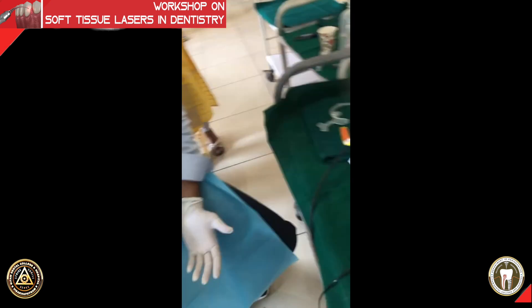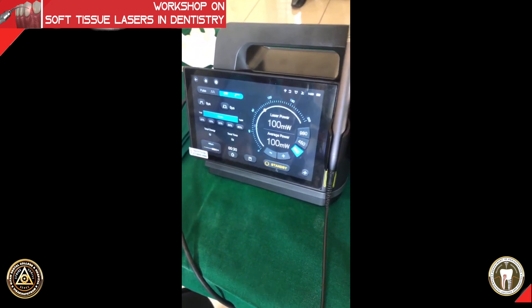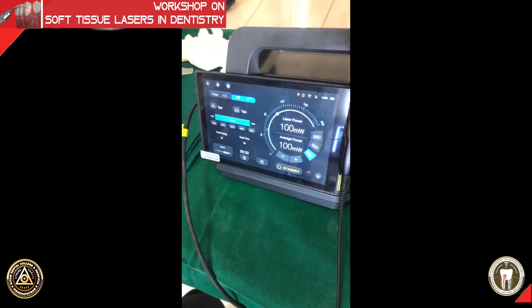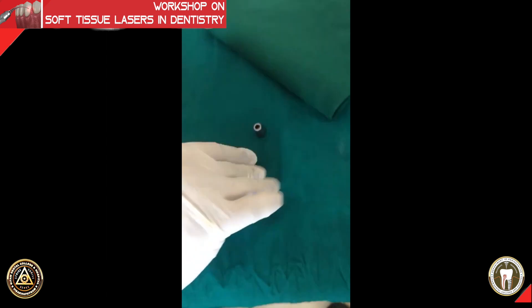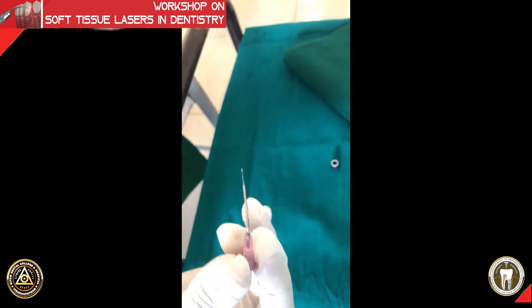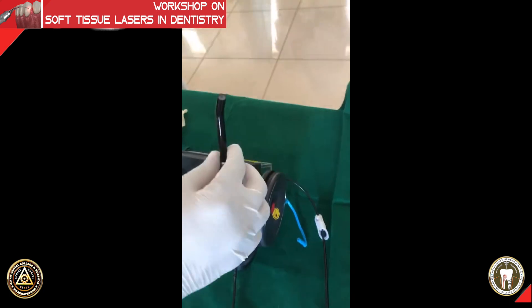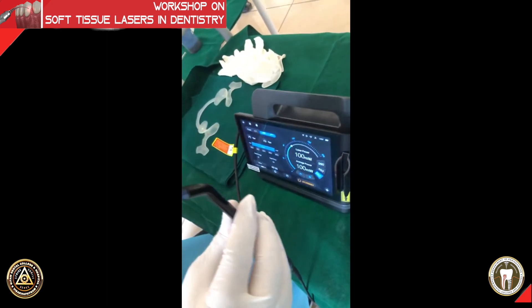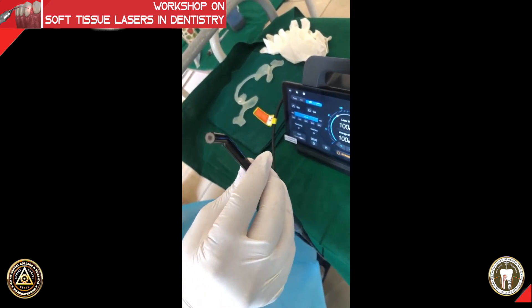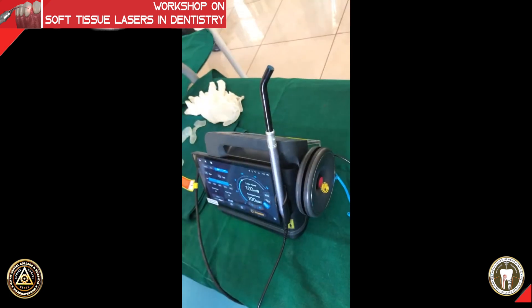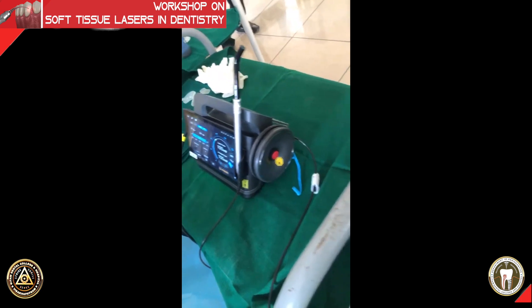There are two techniques of irradiation. The intrasulcular technique — especially if you are using 980, 940, or 810 nm (for 810 you use indocyanine green dye, not methylene blue) — uses a regular tip inserted into the sulcus. The extrasulcular method uses a handpiece with a broader working area that irradiates from outside the gingiva into the sulcus area. Both methods can be used depending on what equipment you have available at the time.